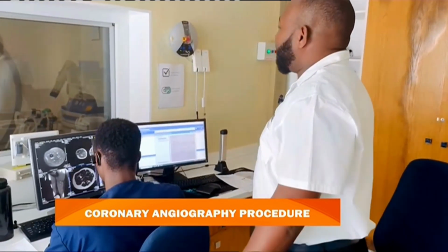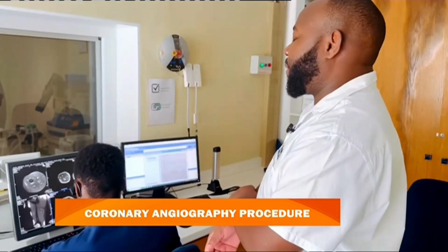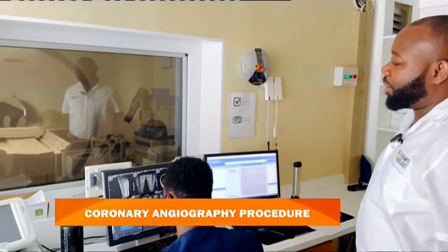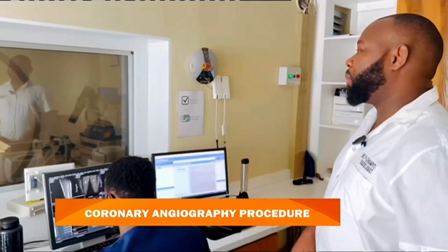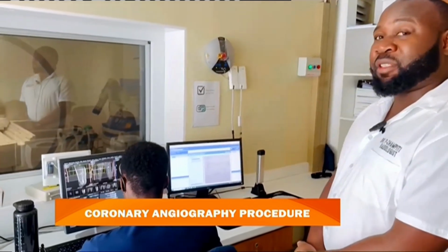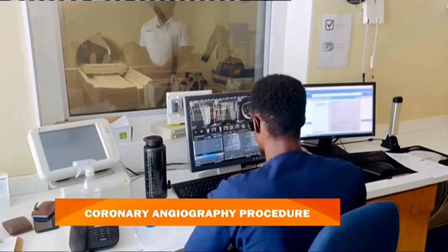This is an MRI machine. It's a machine that uses both magnets as well as radio frequencies to image patients' parts of the body. So you can image from the head to the toe, and each one of them is done in a very different way with very different sequences. We call them sequences because we are using radio waves and magnets.